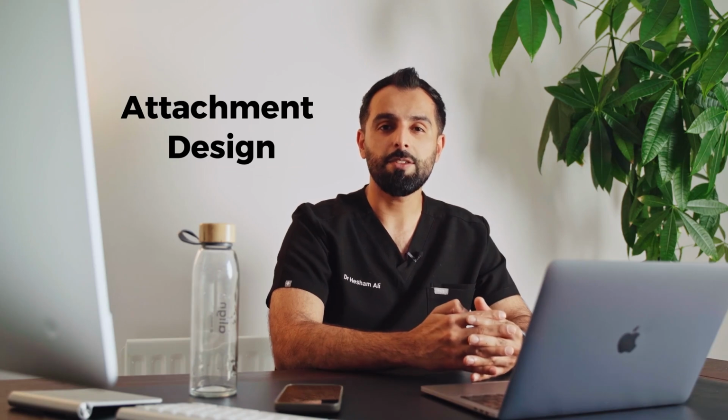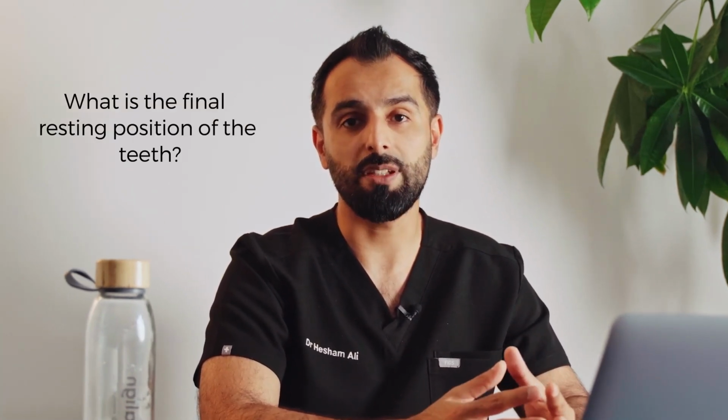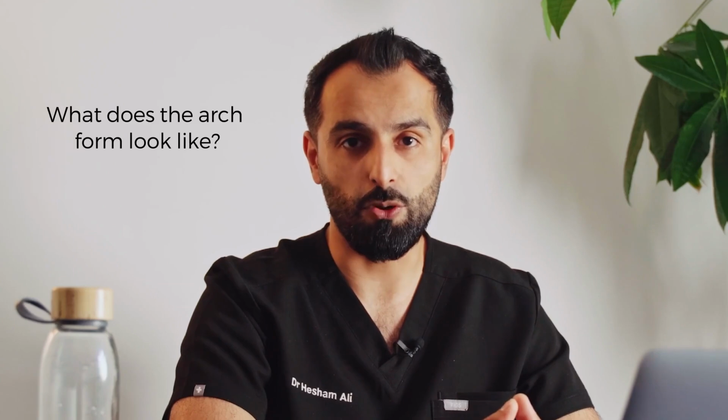With regards to attachment design, that's something I tend to focus on a little bit later on. And the reason for that is, from the first plan, what I'm really trying to get is an understanding of how can I align these teeth, what is the final resting position of the teeth, what does the arch form look like, and those are the instructions that I'm trying to give to my technician. I'm not really interested right now in the staging of the treatment. I'm not particularly interested in the attachment design or anything else. I just want to look at the final outcome and where the teeth are going to be positioned.